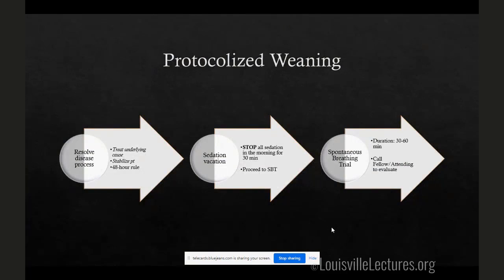So once the patient's better, they're improving in terms of oxygenation, their metabolics are under control, make sure that you stop all sedation in the morning. There's a habit at U of L where we wean down sedation. That's not a thing. You just turn it off with the nurse, and then wait 30 minutes and then proceed to a spontaneous breathing trial.